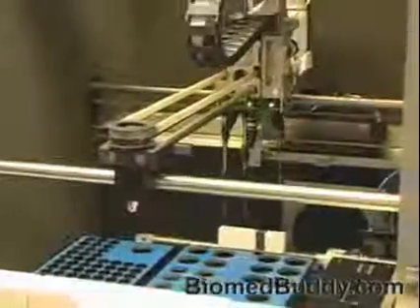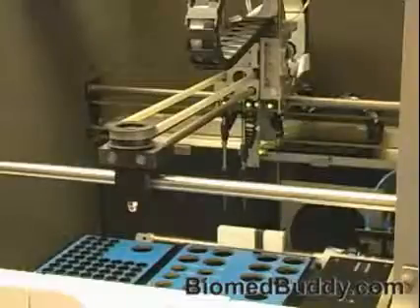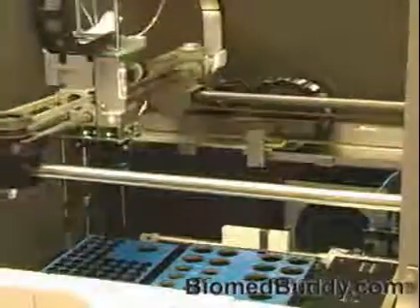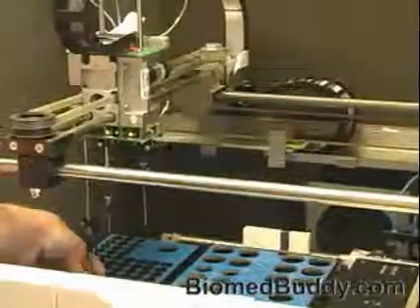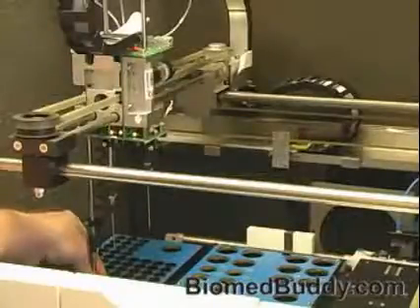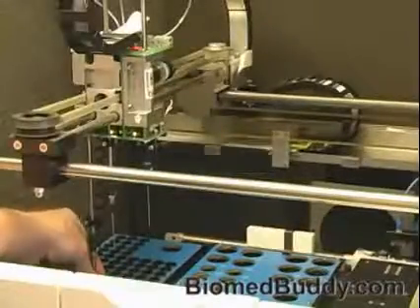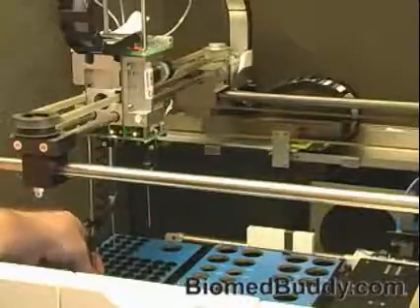And just for grins and giggles, I normally do not do this, I'm going to hit F3 to test it, and we'll hit F10 to validate, and it goes all the way down into the needle. I'm going to pick this needle up, and you see I got a little room, a little space in there. Normal, as it does this little subtraction so it doesn't go to the bottom, and that is what determines how low that needle goes.